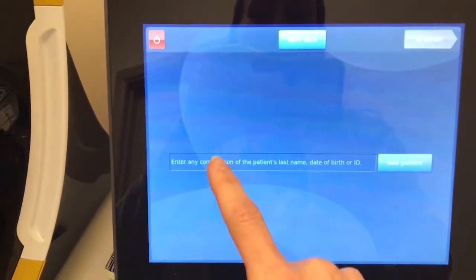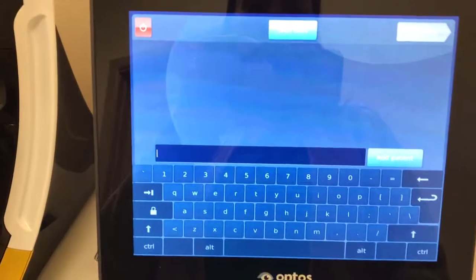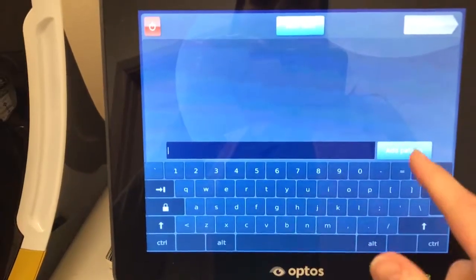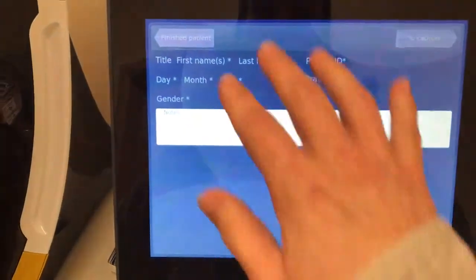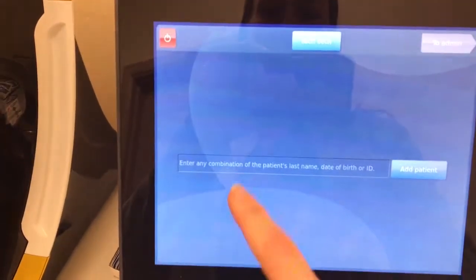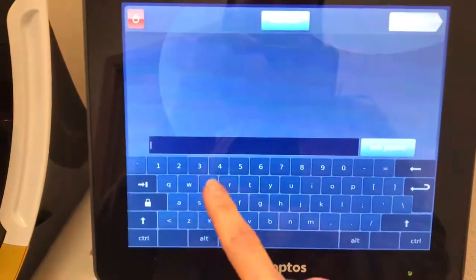you'll see this screen. If it's an existing patient, you can click there and type their account number or their last name and it'll pull them up. If it's a new patient, you hit Add Patient, fill in all that data, and then hit To Capture. But our patient sitting here has been here before, so I'm going to go ahead and type her name in.